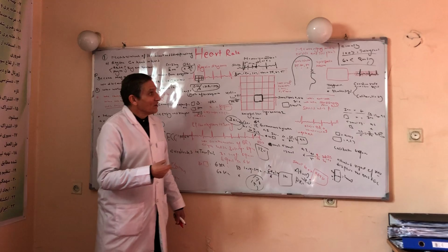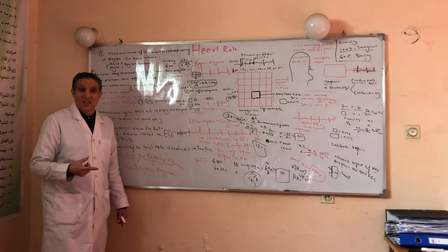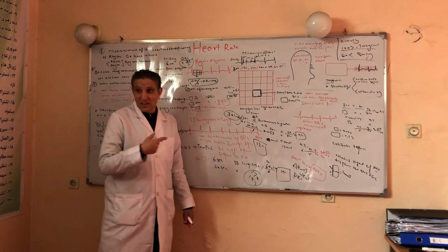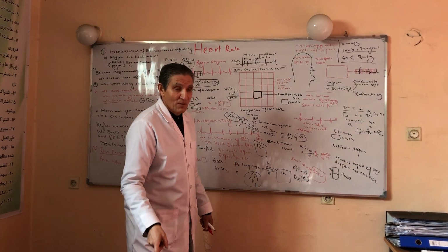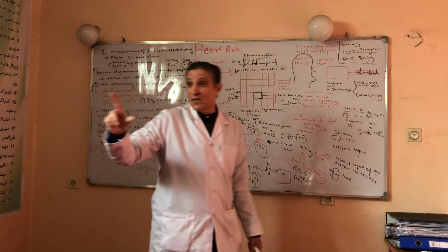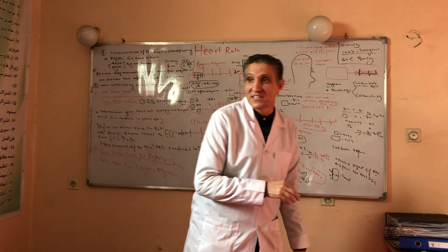After we come from the sinus node, we will come to the AV node: 1st degree AV nodal block, 2nd degree AV block, 3rd degree AV block. After that, we come to the bundle branches, left bundle branch and right bundle branch. Finally, we come to the fascicles, anterior fascicular block and posterior fascicular block. And finally, under the topic of bradyarrhythmia, two other things: AV nodal escape rhythm and ventricular escape rhythm. These matters should be explained one by one under the topic of bradyarrhythmia.